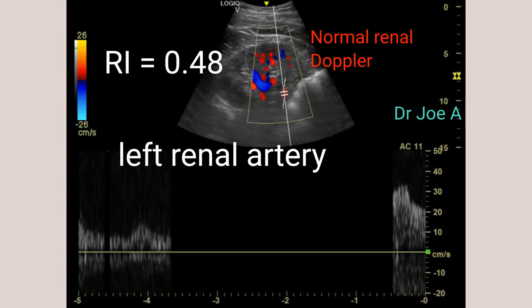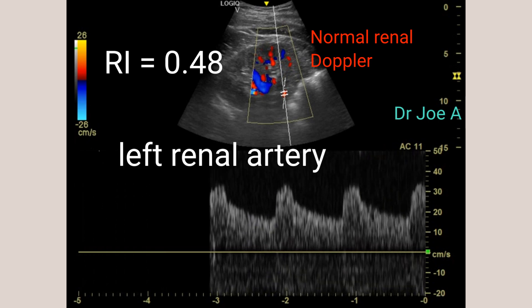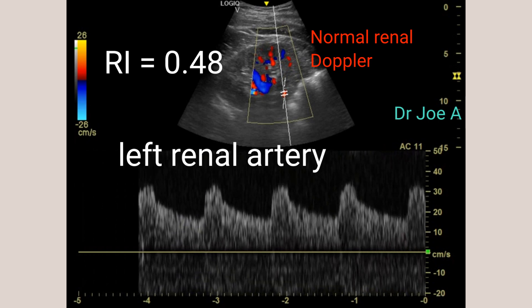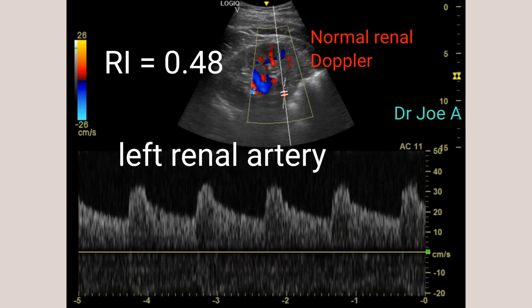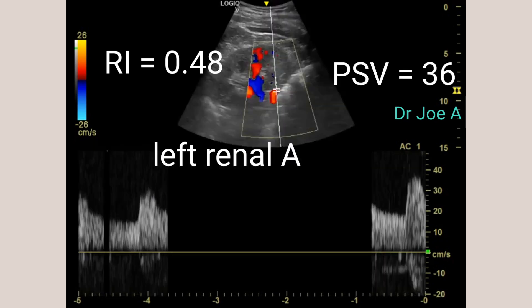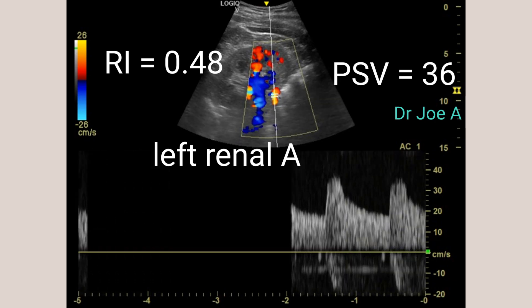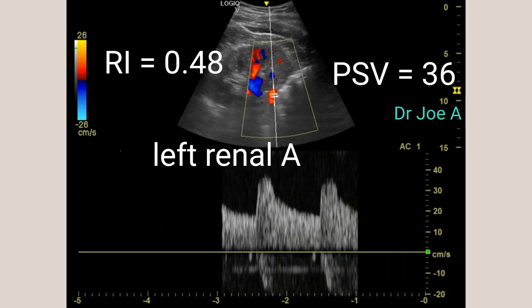This is an adult male patient who presented with hypertension. Renal Doppler was performed, which turned out to be normal. Color Doppler ultrasound showed no significant abnormalities in the renal arteries, indicating normal blood flow patterns and absence of any stenosis or obstruction.